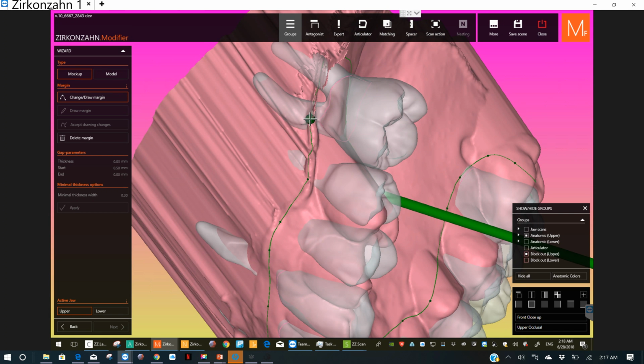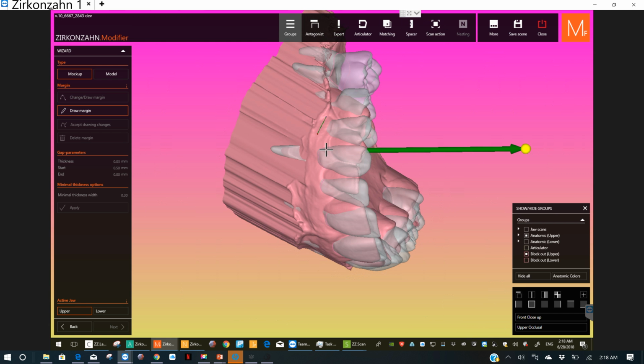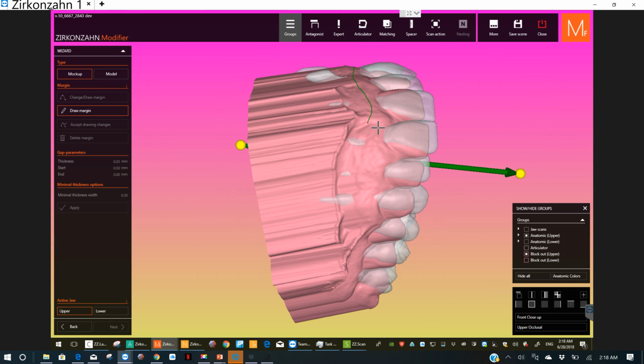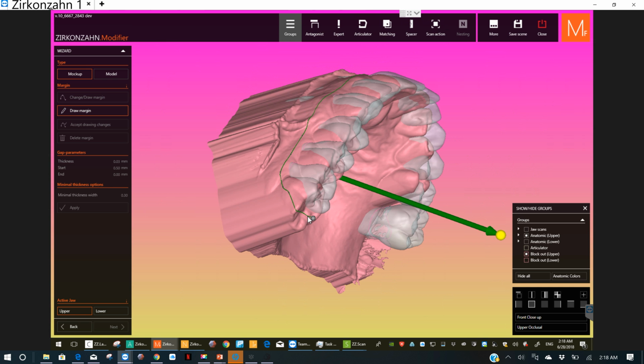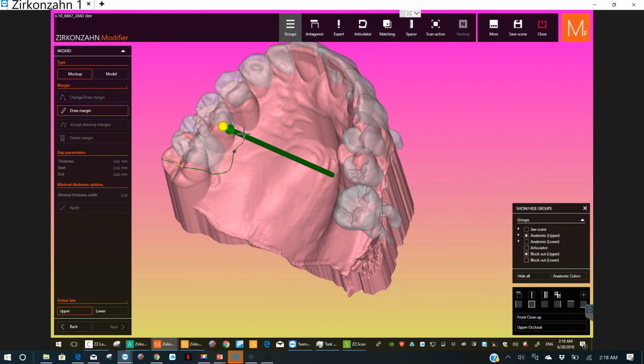There's something over here. Okay, I'm just going to delete it and try again. You're more likely to get a yellow if you do too big of a space, so doing more little clicks is probably better. There's a yellow. Best just to finish your thing and go back and get it later.